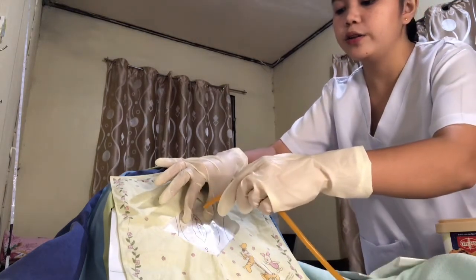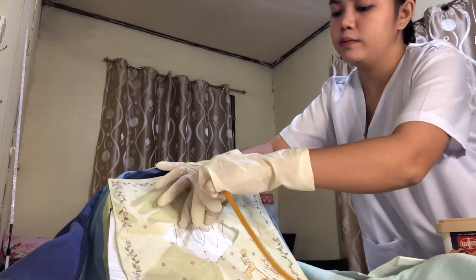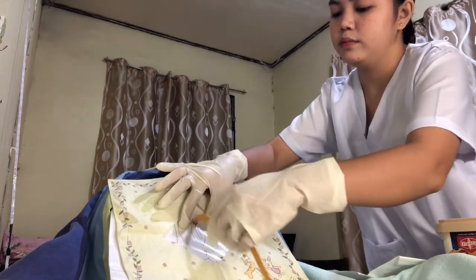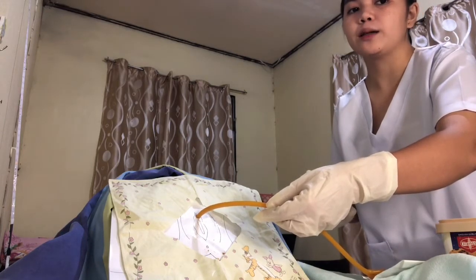So slow, deep breath. Okay. The female urethra is approximately 1.5 to 2 inches.